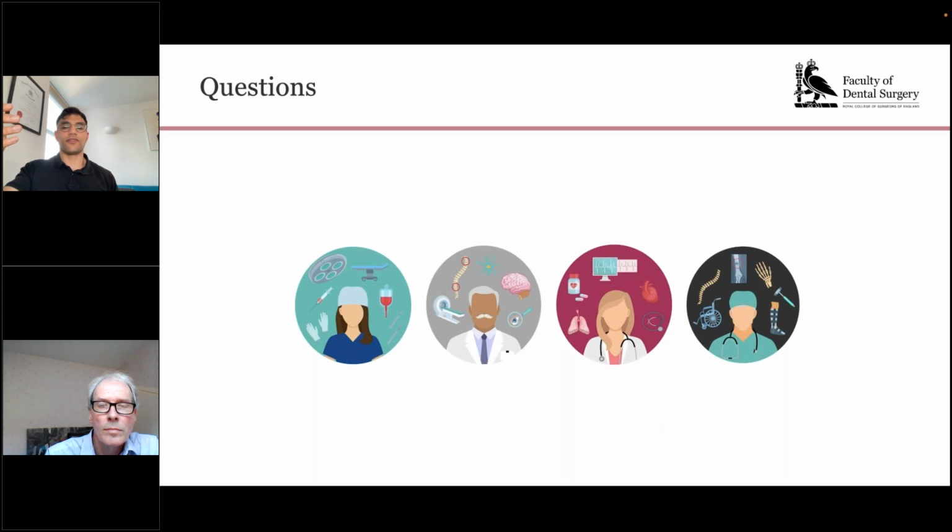So that does suffer when you put the f-stop down. However, you can set up the autofocus so that it's focusing at teeth at midpoint in the arch, like the canine or the first premolar, and that way you give the photograph every chance of capturing as many teeth in sharp focus as possible. So I think you should lean on technology when it can help you and when it can give you good and consistent results.